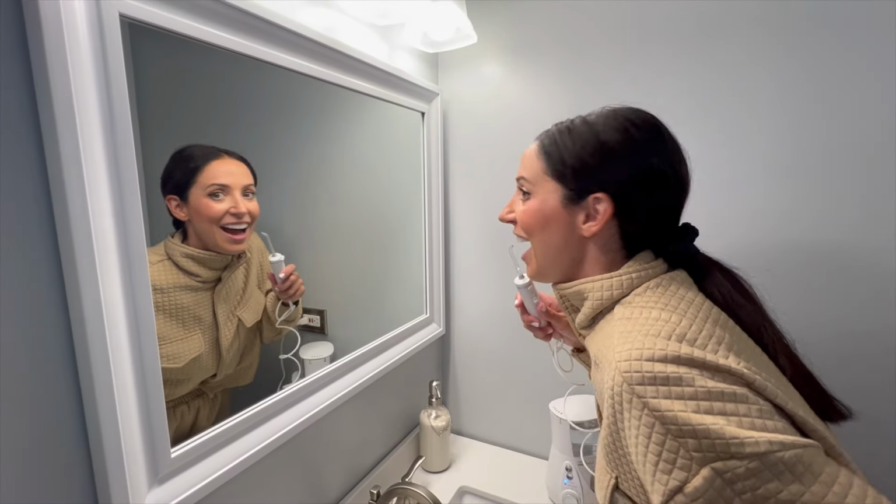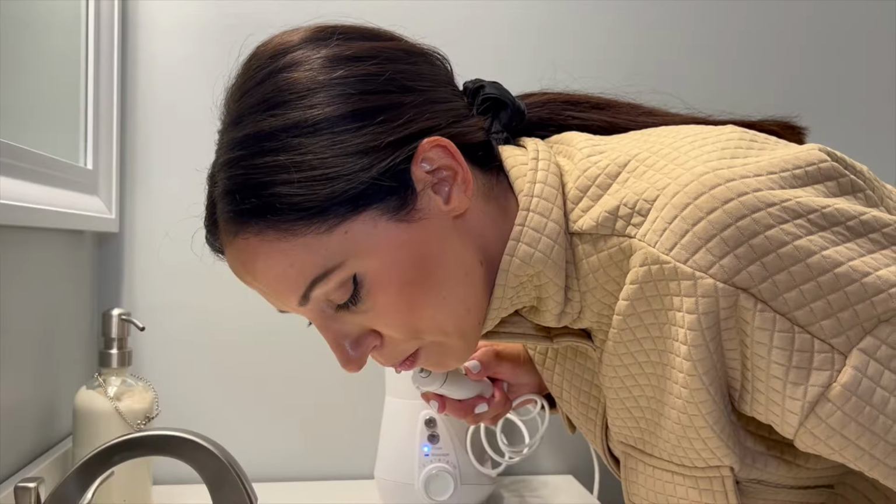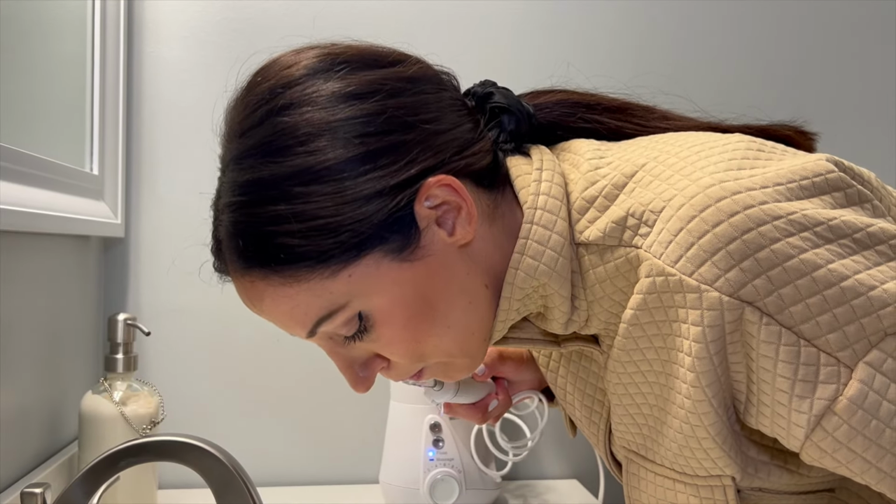As you floss, you want to close your lips enough to prevent splashing. Never stare at yourself in the mirror with your mouth open because water will go everywhere. This is where most people mess up because they want to see what they're doing. But you really have to just feel what you're doing. Feel the pressure. You can't be looking in the mirror. For best results, feel where your gum line is. Maybe even check it out beforehand. Practice without the water spraying.